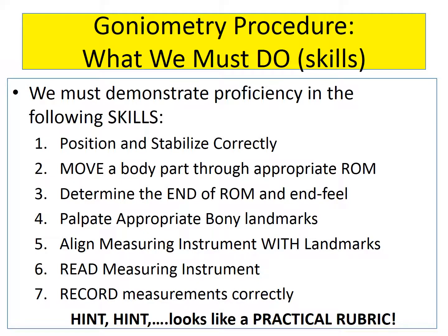You have to be able to determine what an end feel feels like and know what is firm, what is hard. You have to work on your palpation skills to make sure that you are palpating those bony landmarks that you learned in anatomy. You have to make sure that you can read your instrument correctly and then record your measurements. So this will all be part of your practical exam that you will be taking this semester.